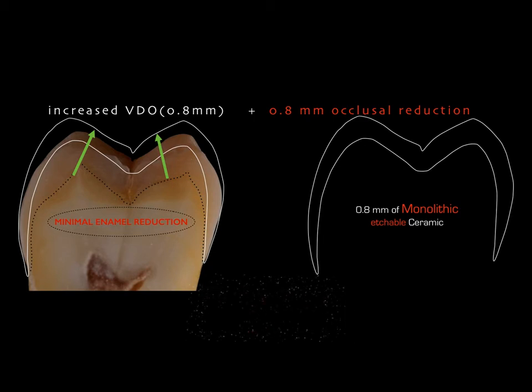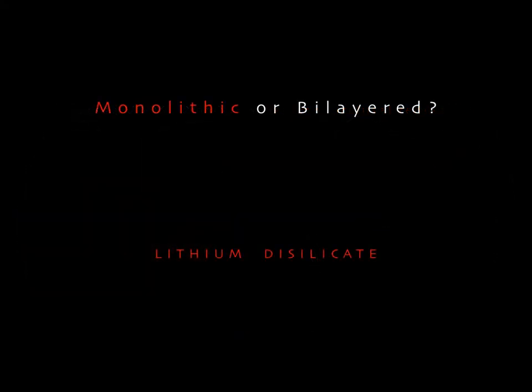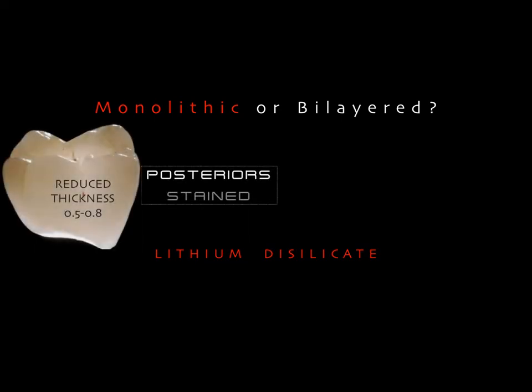And that is, with increase of VDO, you have achieved the combination between increasing VDO, 0.8 millimeter for each arch, plus 0.8 for occlusal reduction. We really have the chance to save the tooth structure as much as we could, almost nothing, almost no preparing. So now the chance is monolithic or bilayered. And at this point, as you can understand, posteriorly, we normally use the stain solution. It means the monolithic solution with reduced thickness, 0.5, 0.8 millimeter.